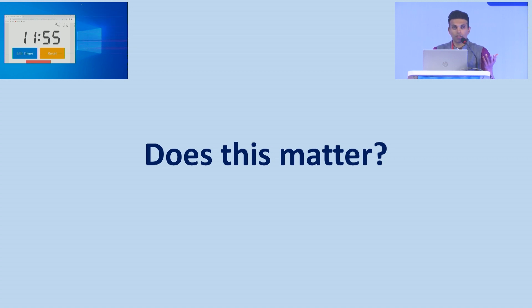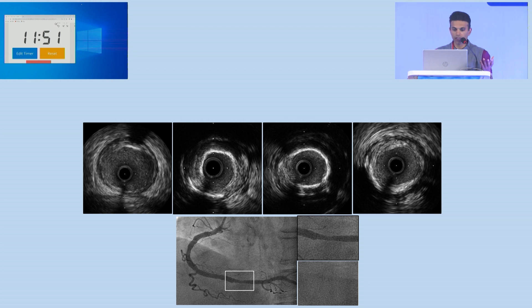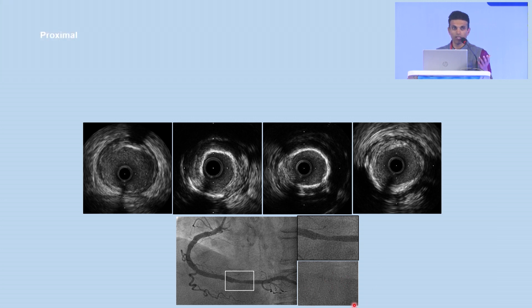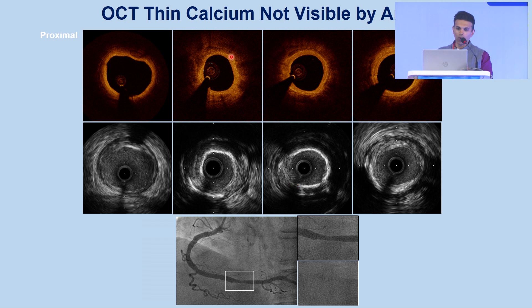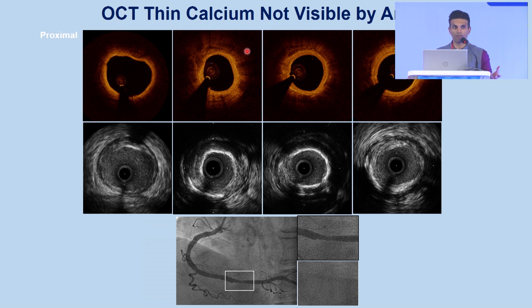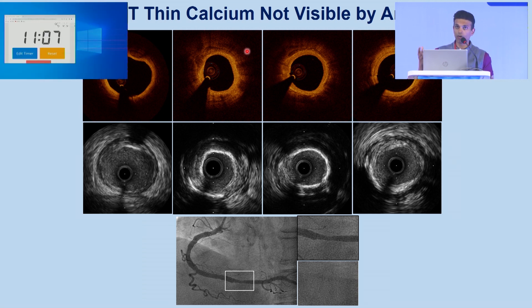Does the amount of calcification matter? Let's look at this case where angiographically you don't have a ton of calcification — this is the cine without any contrast and you don't see much calcium. But then when you look at the IVUS, you have a fair amount of calcification, 360 degrees in one place. What's worth remembering is it's not just the arc of calcium that matters — it's the whole picture. In this case you have lots of calcium on IVUS, but when you look at the OCT, you see that most of the calcium is actually really thin. This makes us think about what variables on the calcium are actually important for interventionalists to decide how to treat a vessel.